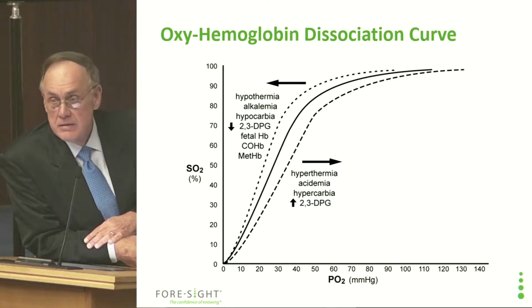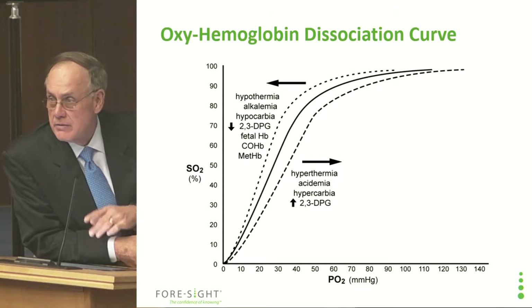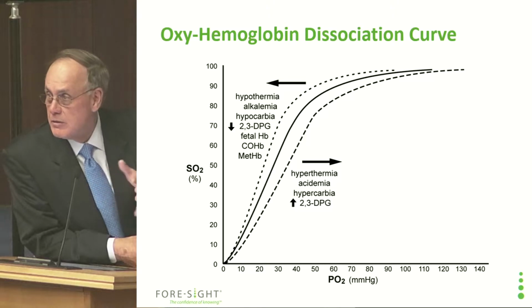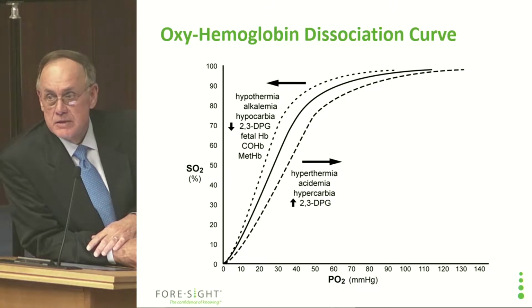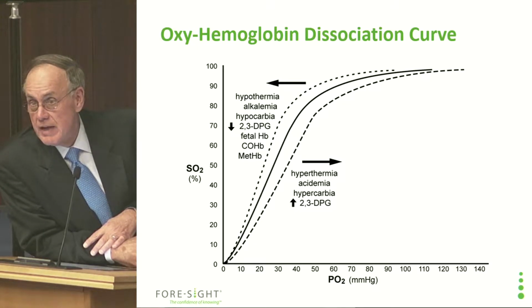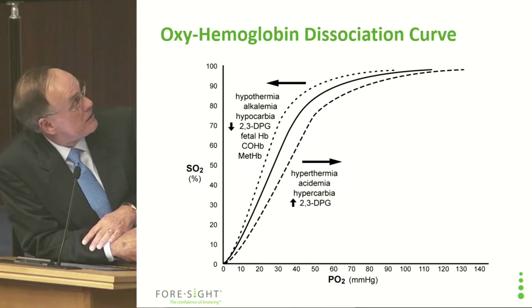And in America, we measure this partial pressure of oxygen by millimeters of mercury. I don't know if you do also. Some kilopascals, yeah. But what a cerebral oximeter actually gives you is the information on the saturation value over here, the percentage of hemoglobin saturated.